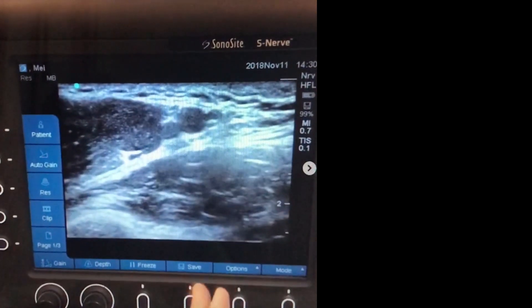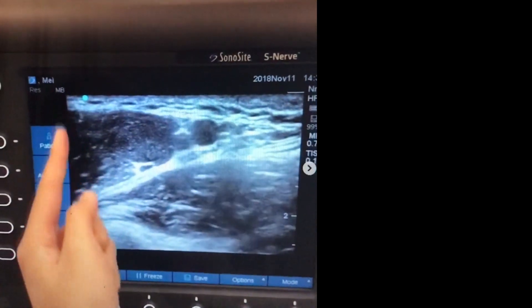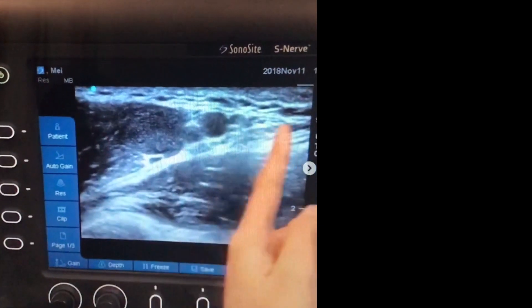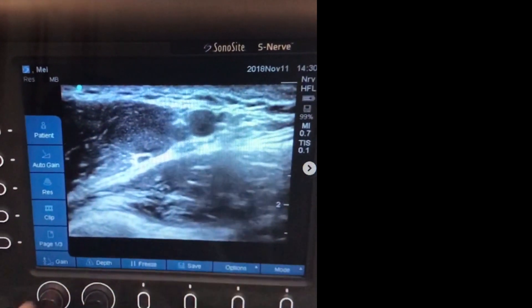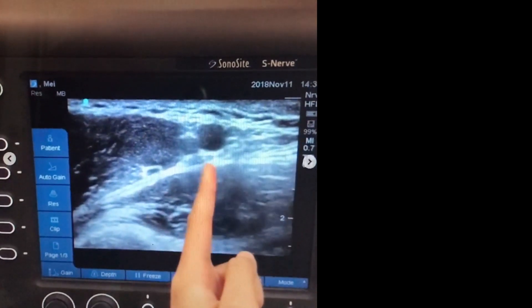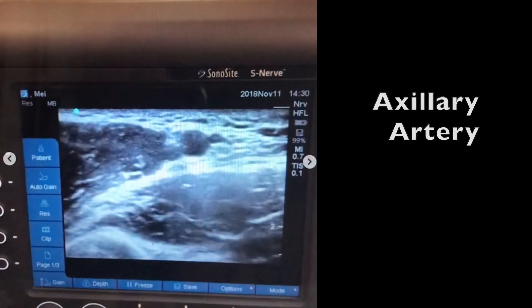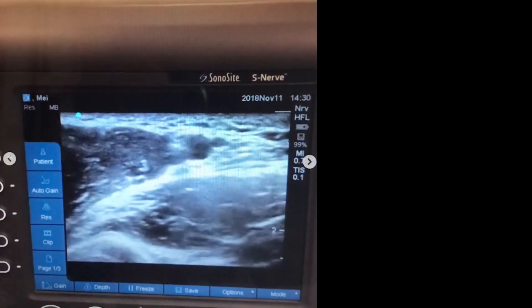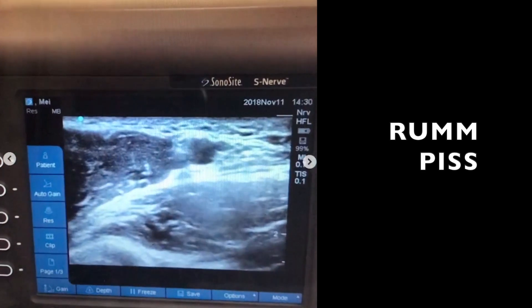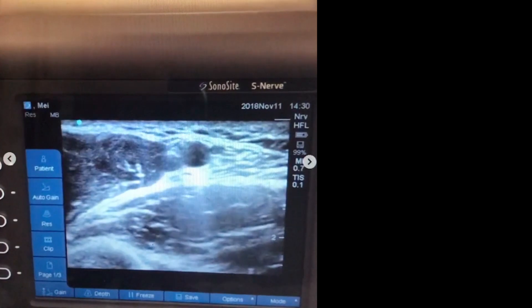When you're looking at the screen, the left side corresponds to the top of the arm and the right side to the bottom of the arm — orient yourself that way. Once you have this view, you'll see the axillary artery, which is apparent because it's pulsating. Using the RUMPUS acronym — I know it's a weird one but it works — you can find the nerves in relation to the axillary artery.